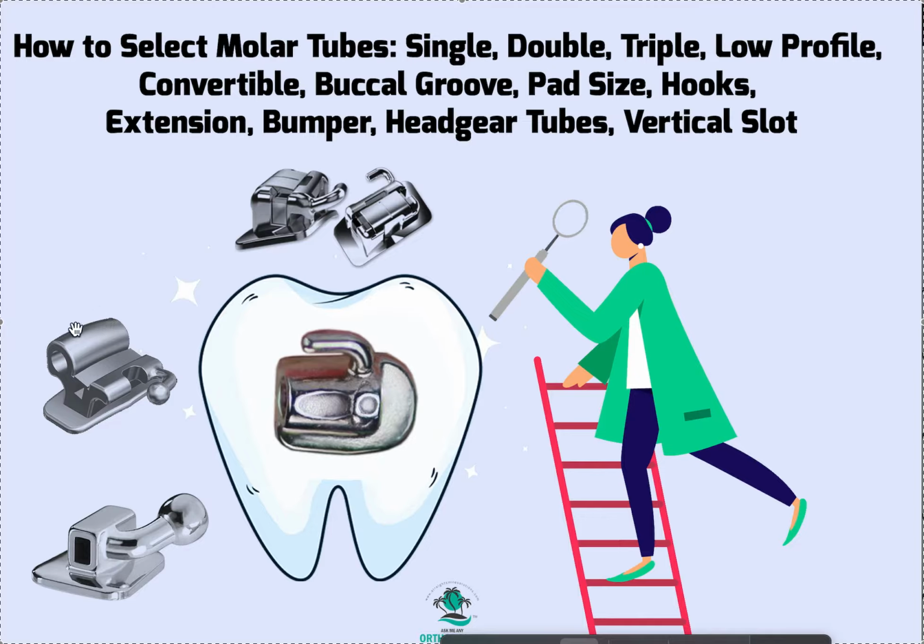The only other time I use a headgear tube is for lip bumpers, but I wouldn't do it on a bracket anyways. I do it on bands. So you only need a single tube. No double, no triple.